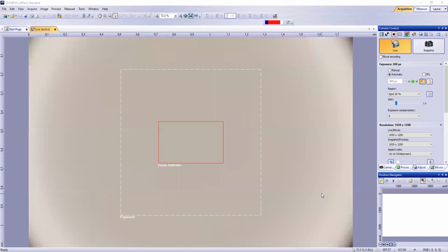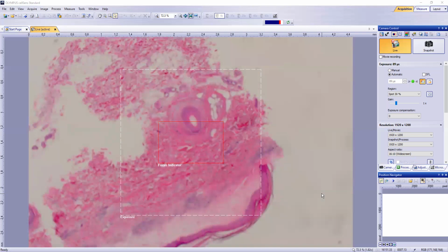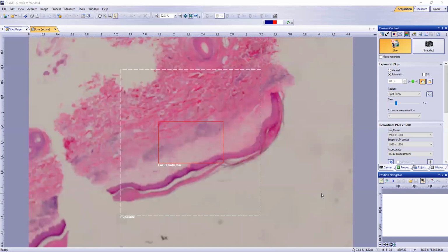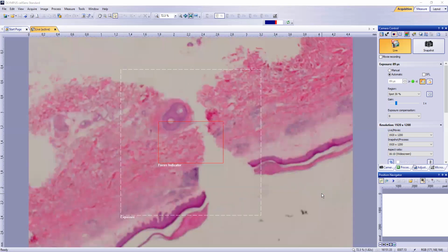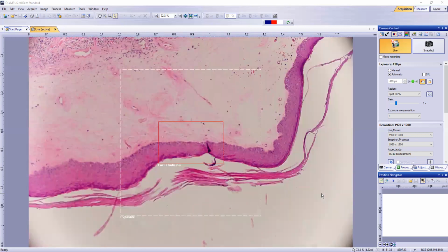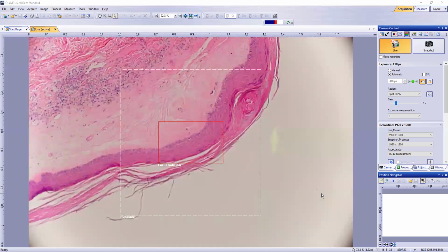The next set of entities I want to review is lichen sclerosus atrophicus and scleroderma. Scleroderma is not an interface process, but I want to use it to distinguish one of the key features in lichen sclerosus. And so in lichen sclerosus here, we've got a punch biopsy down to the superficial subcutis. And in lichen sclerosus atrophicus, orthokeratosis tends to be very striking. So you can see that there's some compact keratosis or orthokeratosis of the stratum corneum.